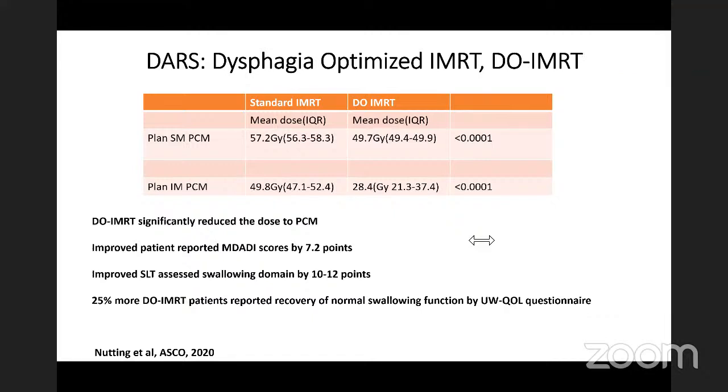Sir, are you routinely using the adaptive technique in oropharyngeal cancer, whether the tumor has shrunk or not? No, not at this point. The only adaptive we do is what all of us do in the clinic. You are doing cone beam CT. If your setup uncertainty or your SSD varies by more than 1 centimeter, then you continue the treatment but replan and rescan the patient without interrupting the treatment. So you account for change in anatomy. That happens in patients who have weight loss, and in patients with bigger nodes which regress. So you have to account for it.